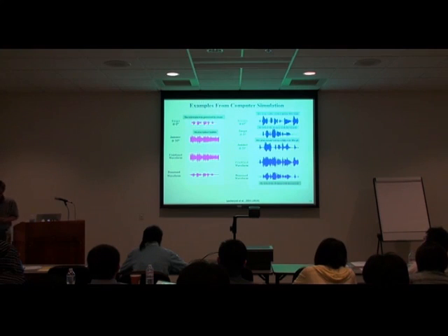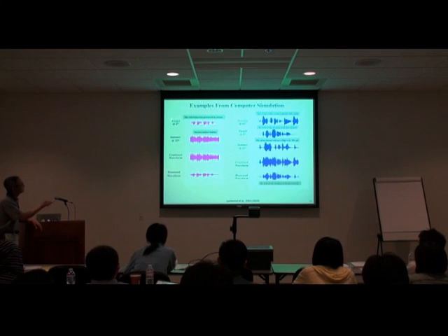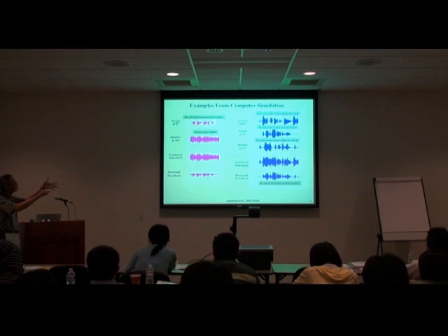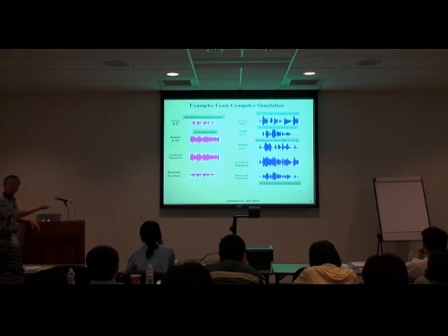And this turns out to be quite encouraging, because we can determine using computer simulation that we have a target signal at 0 degree, let's say, producing the sound. And you can have 12 talker babble that is 20, 30 dB more intense than this target. In theory, this should be masking everything of the combined signal, so it's dominated by the talker babble. But after processing, you can recover the signal completely.